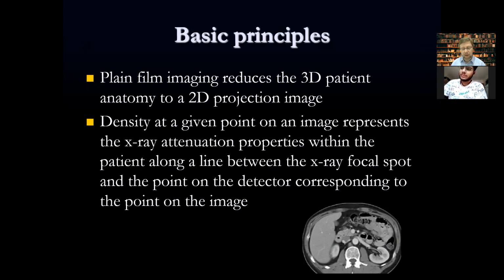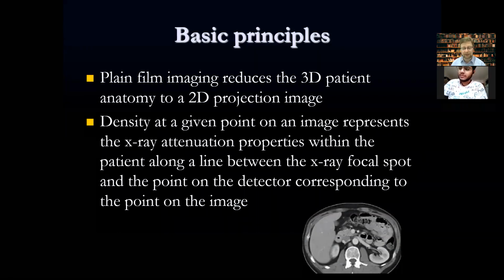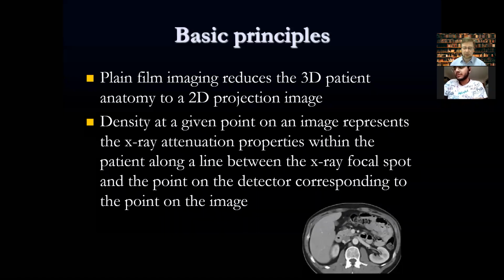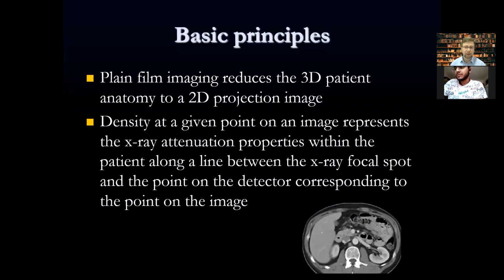If we talk about the previous part of the lecture about plain X-ray imaging, we must mention that a plain X-ray image is just one plain image performed in one or more projections, and very limited three-dimensional data can be achieved during plain X-ray imaging.